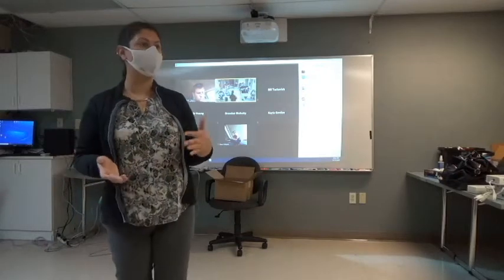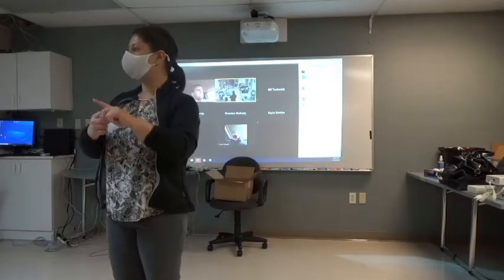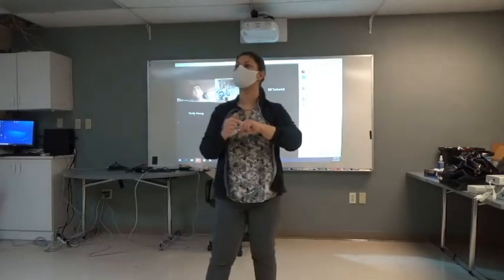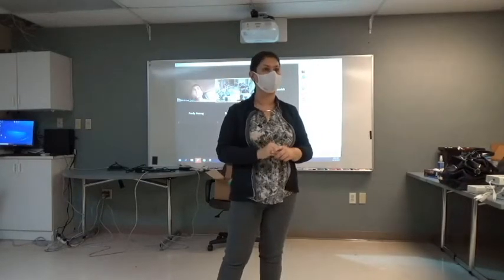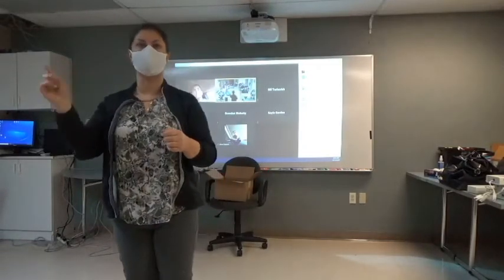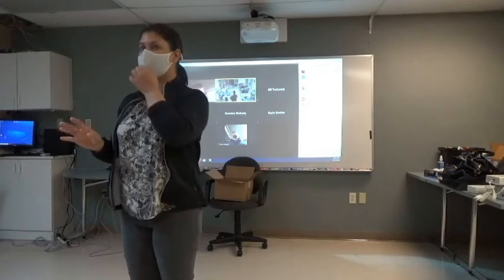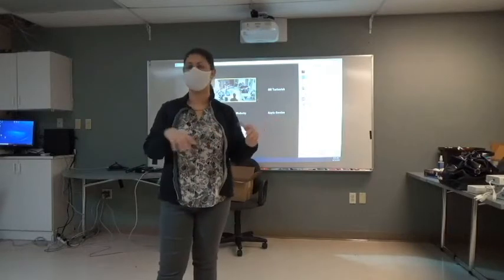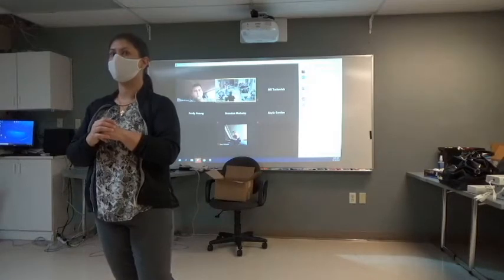So you're looking for a number of one or greater. That is going to tell you you have good perfusion through that site that you picked, and you can probably trust those numbers. It gives you more assurance that you can trust those numbers. So one or greater perfusion index, and those numbers will cycle through at the bottom of your oxygen saturation. If you're having difficulty getting a reading, the manufacturer recommends the patient's non-dominant ring finger. Otherwise, just put it wherever you guys are used to, wherever you're comfortable.